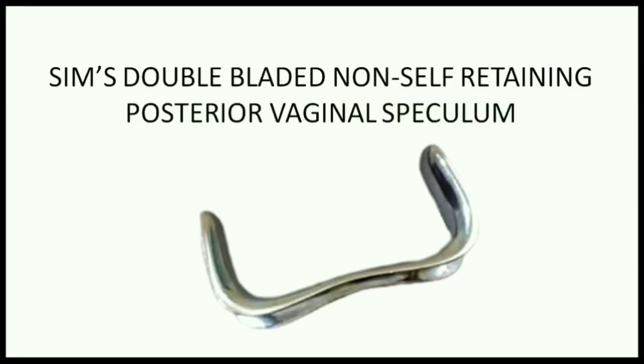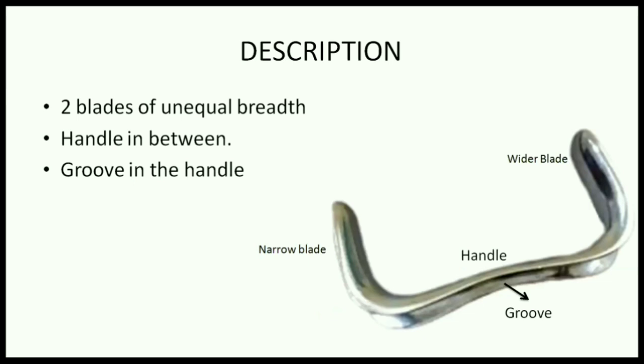This is a SIMS double-bladed, non-self retaining, posterior vaginal wall speculum. It has two blades — a narrow blade and a wider blade — with a handle in between connecting the blades, and there is a groove in the center.